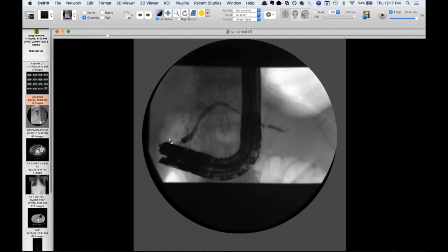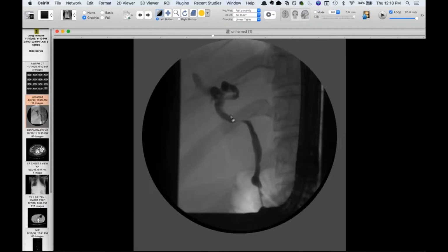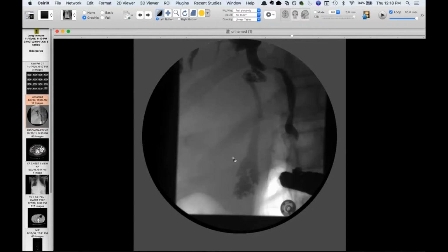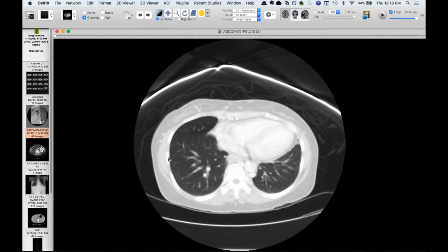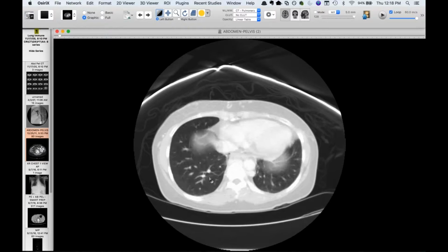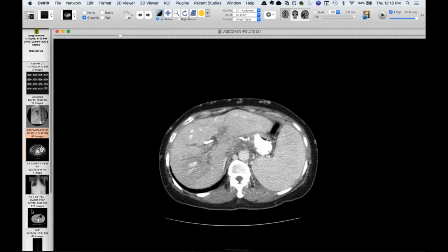And then in 2007, she develops these strictures, as you can see here. And I guess they biopsied something and got spindle cells and thought that she had a metastasis to her liver that was obstructing. It's a kind of a confusing story. But anyway, she's had 3 dozen or more ERCPs since then, every year, putting in biliary stents and whatnot. In 2011, this CT shows that her lungs are reasonably clear, and you can still see she's got the biliary stents and such.